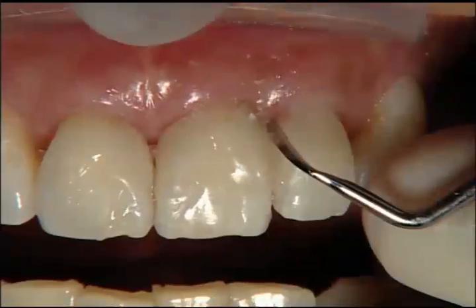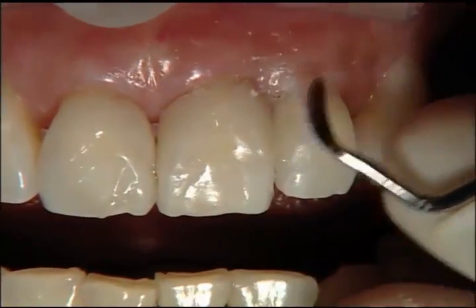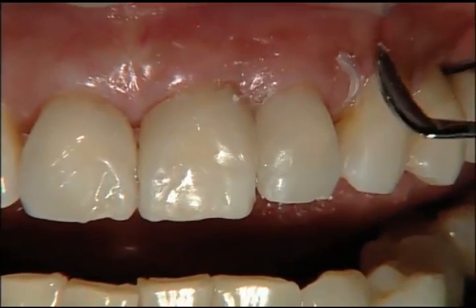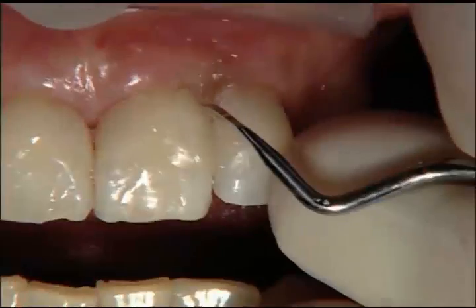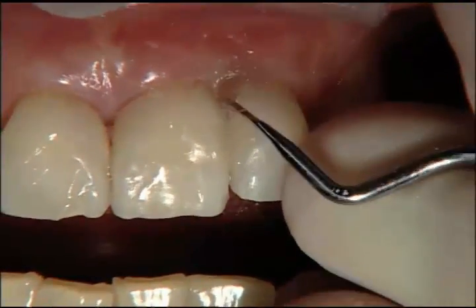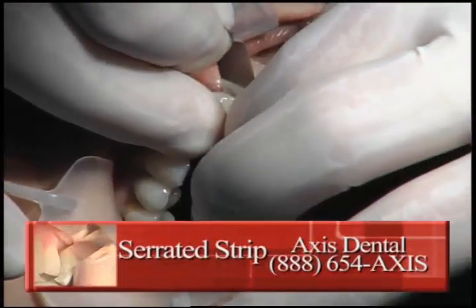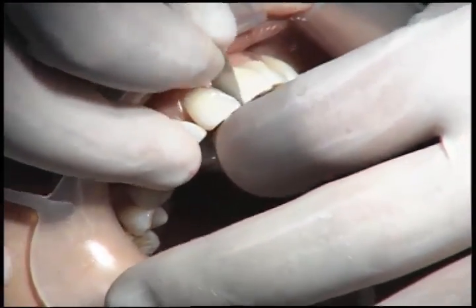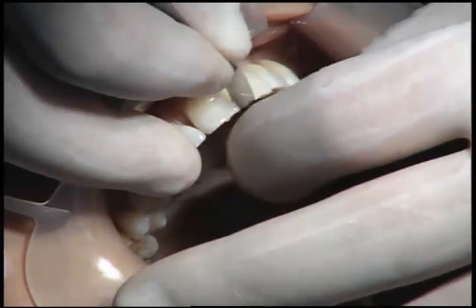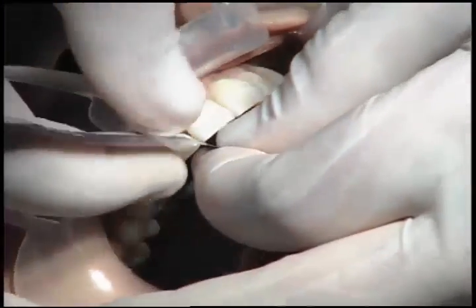My assistant has done the final cure. I've got a gold knife that I'm using right around the gingiva — some clinicians like to use a curved scalpel, and that's fine. I like using something with a metal handle and a little thicker blade; I can use the tip in several directions with a pulling action to chip away at excess cement in the gingival embrasure. This is a safe-sided serrated strip from Axis Dental — smooth on both sides but with a little hacksaw edge. I've found this will cut through any contact that I've inadvertently bonded closed, whether with bonding agent or VarioLink Veneer.